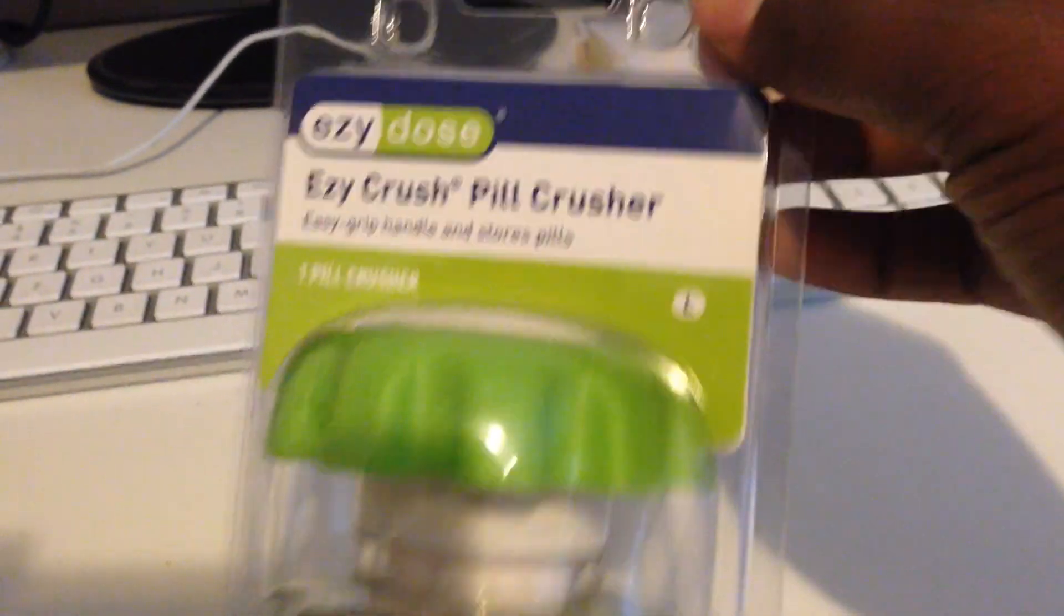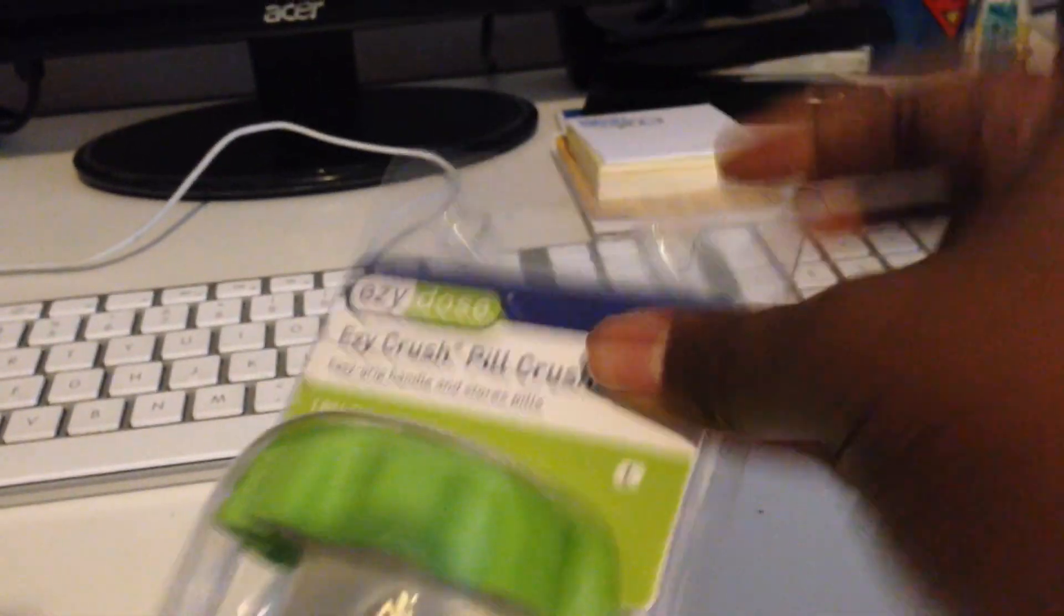Let's go ahead and pop this thing open. I'm struggling here, forgive me. There we go.